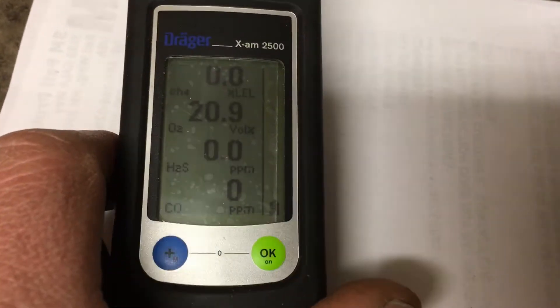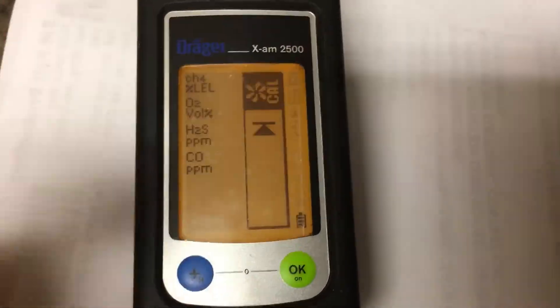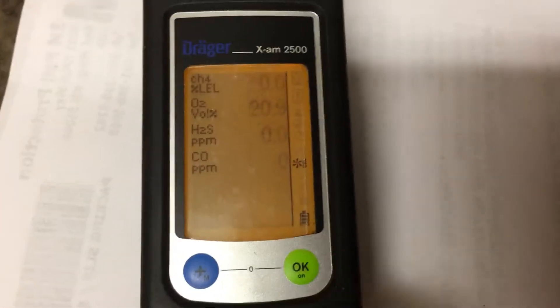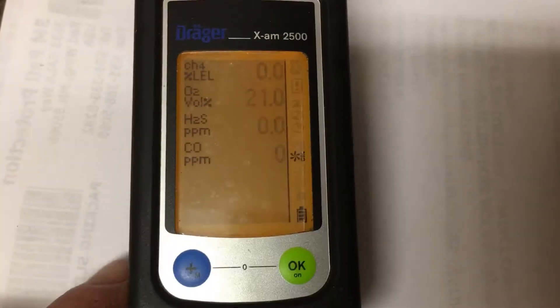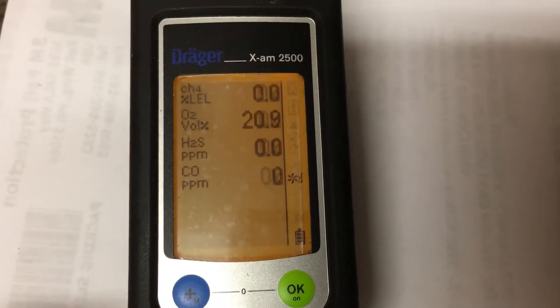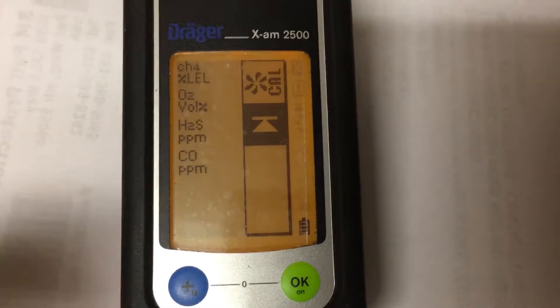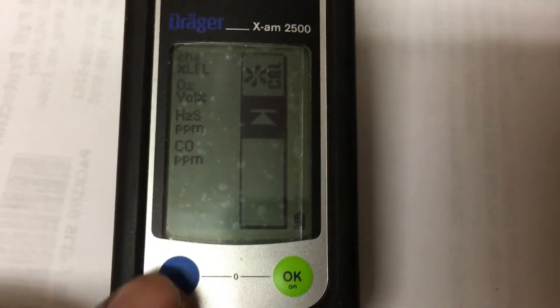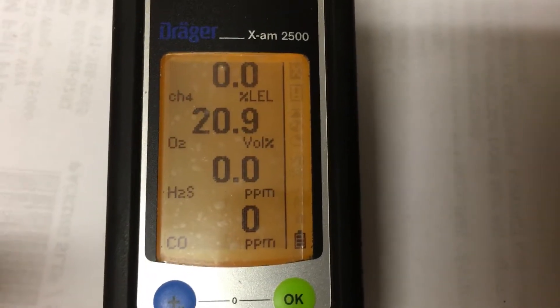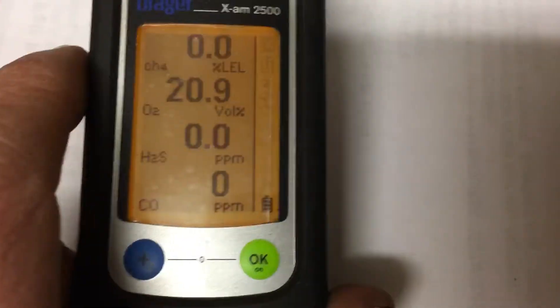To walk through it one more time: push the blue button three times — one, two, three — you get the fresh air cal symbol, then push the green button once. Give it about five flashes or five seconds for it to do its fresh air cal, then push the green button one more time. You get all okays, then the cal symbol. Wait about 30 seconds or push the blue button to go straight back to the main screen.